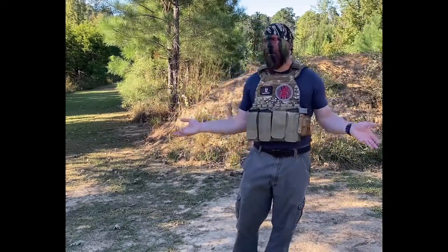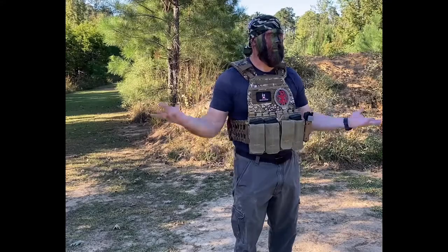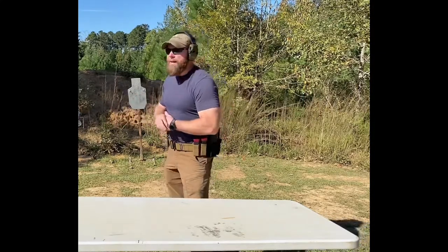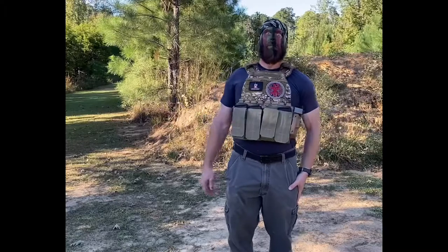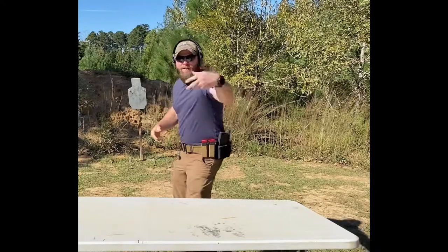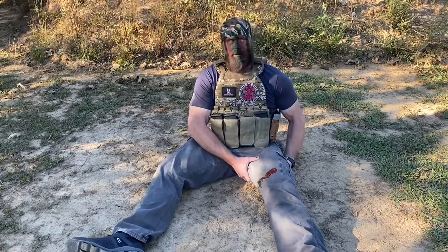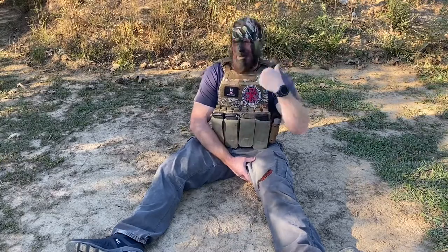Bang — I got shot! Oh no, in the leg. I'm a little bit of a visual learner — I learn better hands-on, seeing what it actually does. Well, I've been shot mainly because Marvin Goss really wanted me to pull out my tourniquet. Thanks Marvin. But what Marvin didn't know is two is one and one is none, because I had a backup.